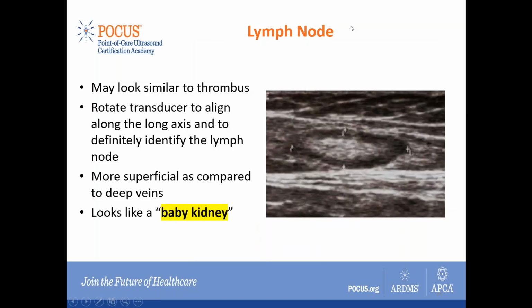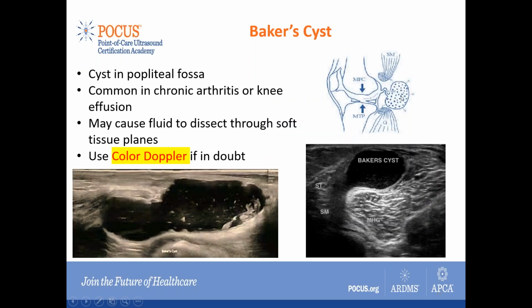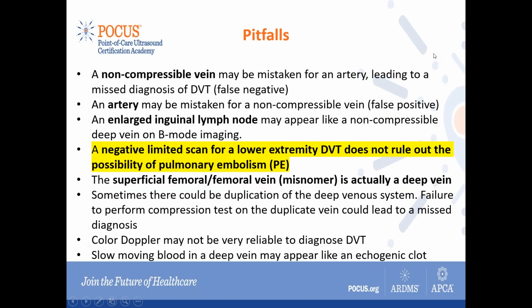So other things to be aware of when you're doing this is to make sure that you know what the appearance of a lymph node looks like. I kind of describe it like a baby kidney. Here's something that you might encounter in the popliteal region. So this is a Baker's cyst. As you can see, it's communicating with the joint space right here, the knee joint. And you can use color Doppler, and there will be no flow in there.